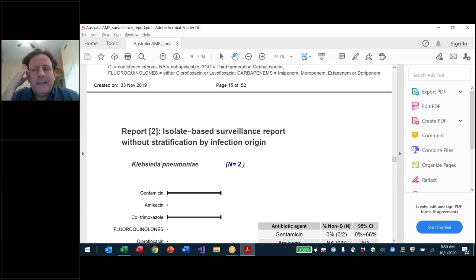If you don't trust their data, don't include their data. Okay, include their data. As you saw in the case of Vietnam, some of the things were purely descriptive. How many bloods did they submit? How many urines did they submit? Whether you're a good quality lab or bad quality lab, those numbers should be accurate. We did 5 blood cultures. Whether good blood cultures is another matter.